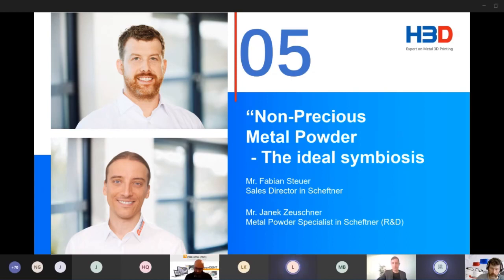If you want to do the partial framework, you have to switch over to the Starbond Easy Powder, which is still a good alloy, and the CTE is still suitable, so you can also use it for crowns and bridges, but the elongation is the very critical value. The elongation is about 10%, so the clasp of your removable partial framework is still flexible enough for general use. So the Starbond Easy Powder 30 microns is for a partial framework.